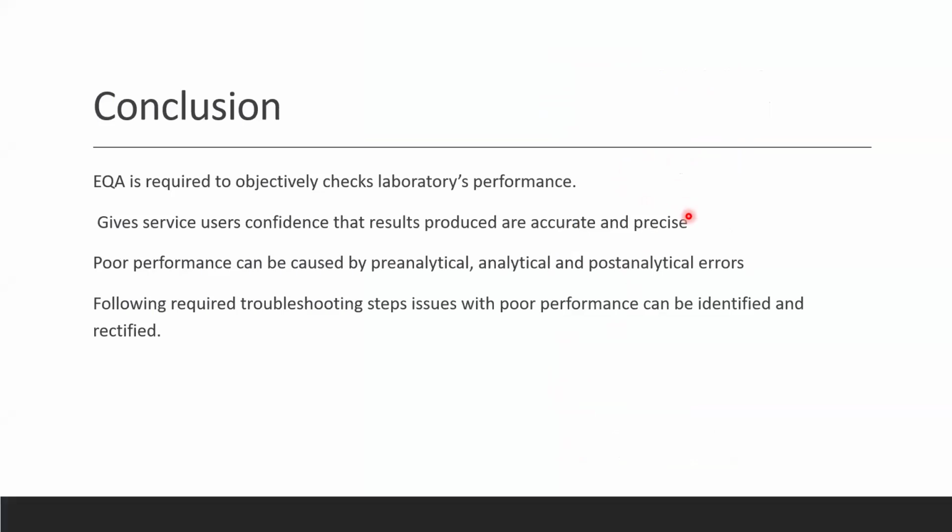And finally, I hope that with this presentation, I've managed to demonstrate why the EQA is required, and why it's necessary to objectively check one's laboratory performance. It gives us as a laboratory, but also our users, confidence that the results which we produce are accurate and precise.